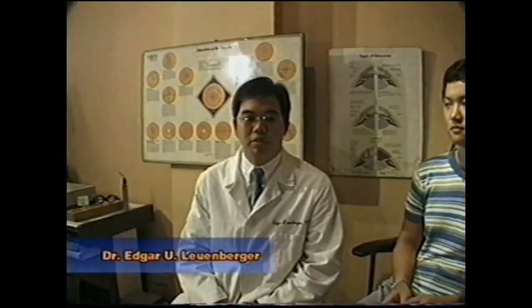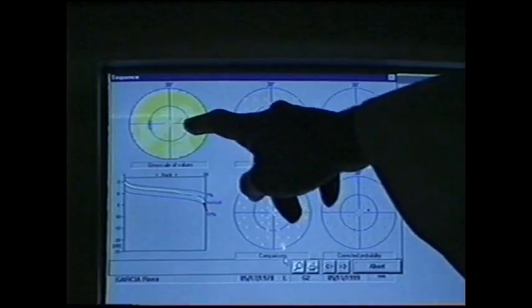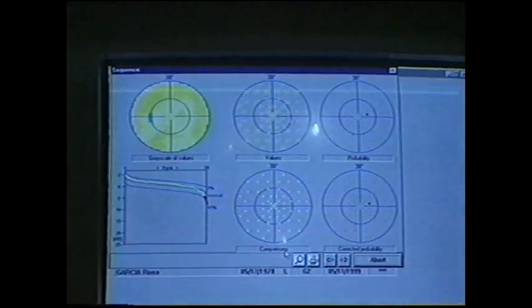Visual field examination. The visual field is that portion of the subject's surroundings that is visible at any one time. The visual fields are routinely screened with a confrontation fields test. If macular disease is suspected to be causing a central visual field defect, a device called an Amsler grid is used to test the central area of each eye's visual field. If a visual field defect is detected by screening, further evaluation is conducted by manual or automated procedures known as perimetry. For our purposes, we shall mainly focus on the screening procedures.